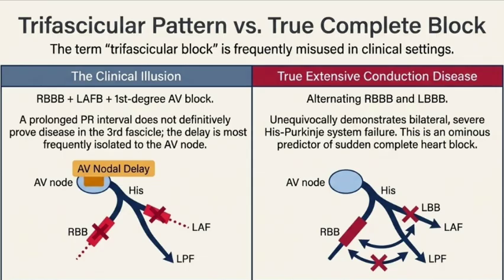Man, if you are ever looking over a doctor's shoulder at an ECG, seeing that specific combination of words is the literal difference between taking a deep breath and slamming the panic button. Truly. The risk of that patient abruptly going into complete heart block and refractory cardiogenic shock is just staggeringly high.